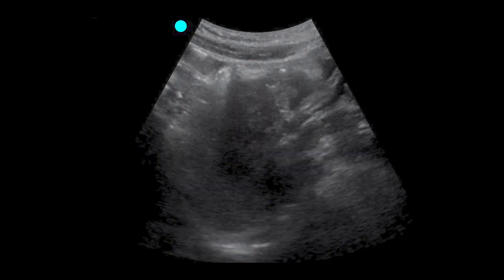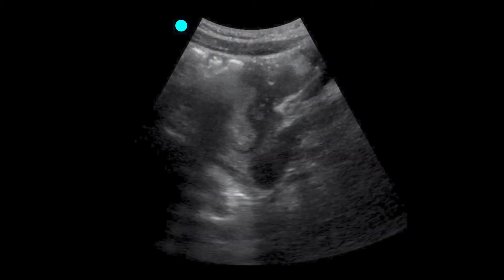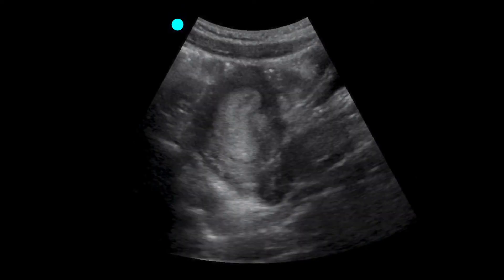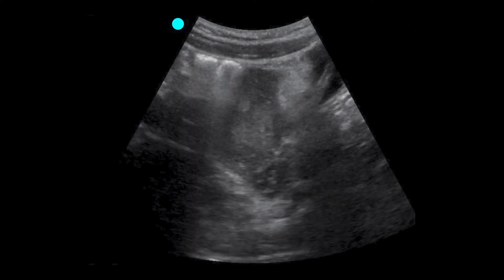We're going to fan over to the patient's right. We don't really see the uterus here, but as we fan from right to left we'll see the uterus come into view and then hit a midline portion where we can see the endometrial stripe. It's quite thick in this patient and that's where we want to look for a pregnancy within the uterus in this long axis. The uterus then goes out of view as we fan further to the left.